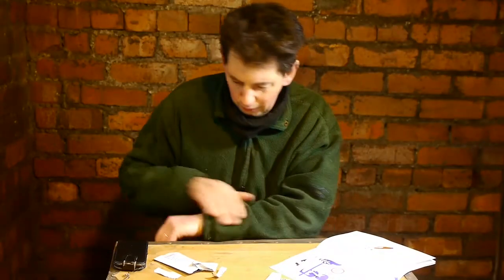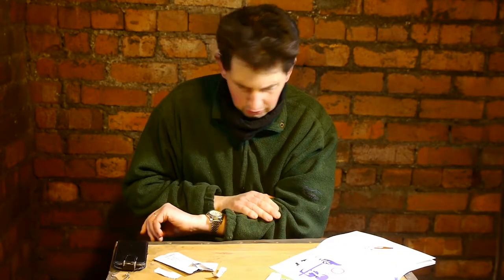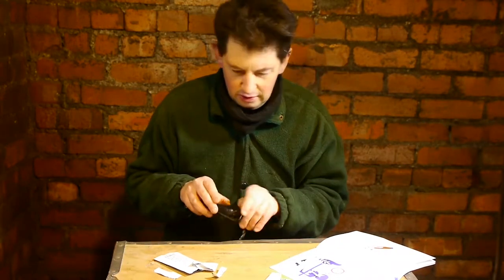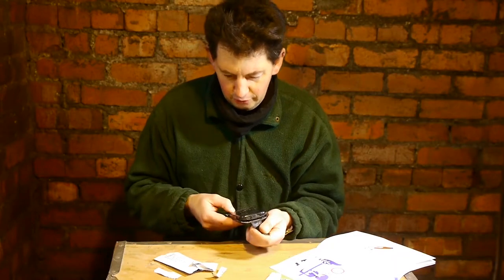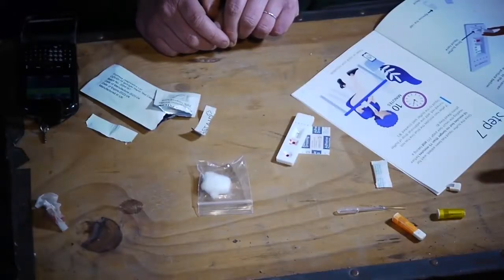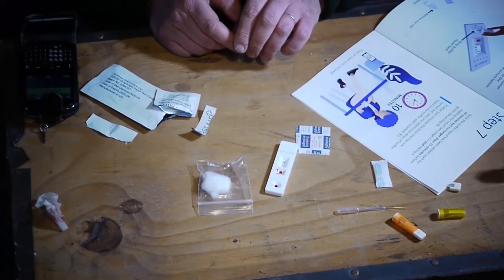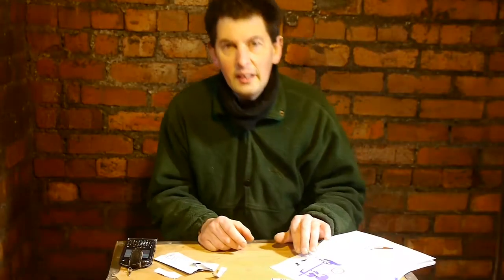Right, now I need to wait for 10 minutes and no longer than 15 minutes. So I'm going to put my timer on and I will move these cameras so you can see the test taking place. And I'll see you again in 10 minutes.